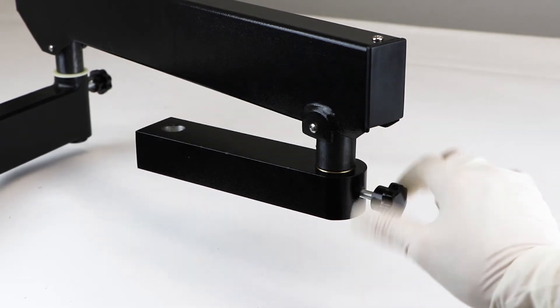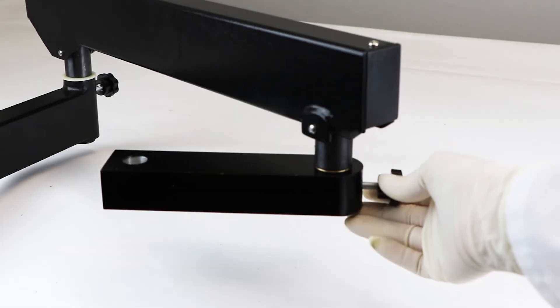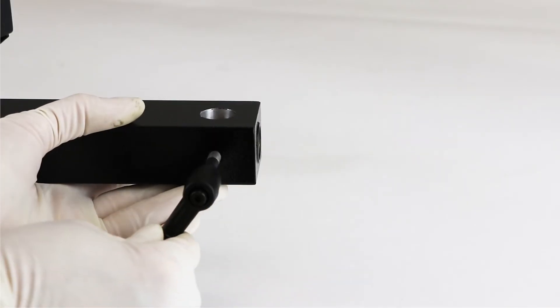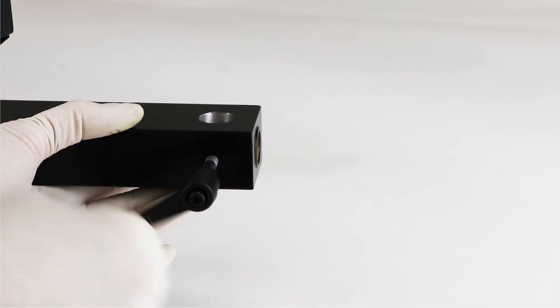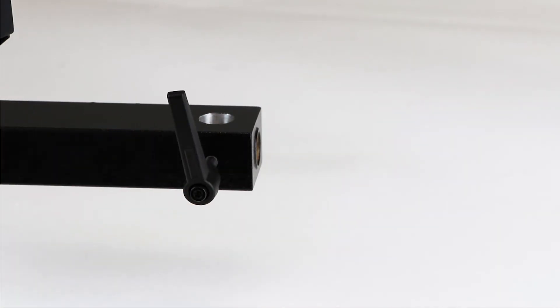This screw may be tightened to fix the position of the small horizontal bar. Line up the clutch handle with the screw hole at the end of the small horizontal bar and rotate it clockwise to screw it into place, but do not screw it in all the way. This handle secures the focus mount.